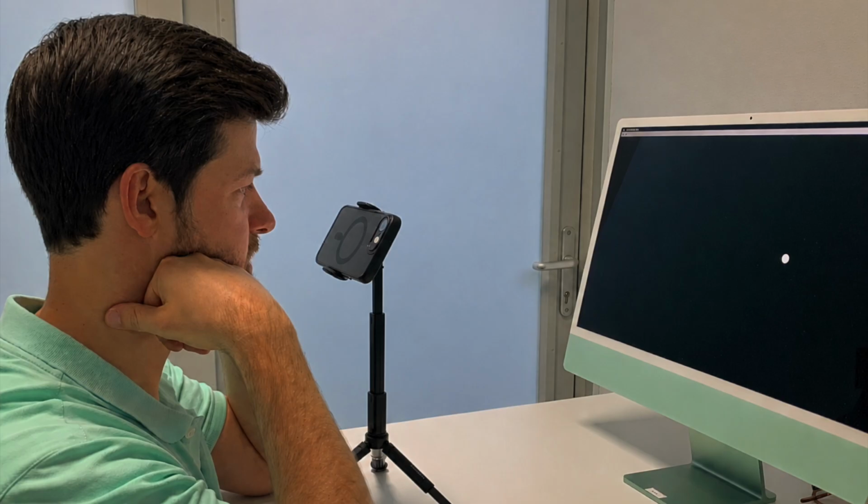It helps to have a desk which can move up and down. Otherwise, you can always use piles of books or whatever works to get things lined up. Also notice that the screen and the target they're looking at is fairly close to eye level. If they look down too much, then eyelids might close a little, and that can obstruct the pupil. Generally not a problem for the phone, but you don't want them looking down too much with their eyes.